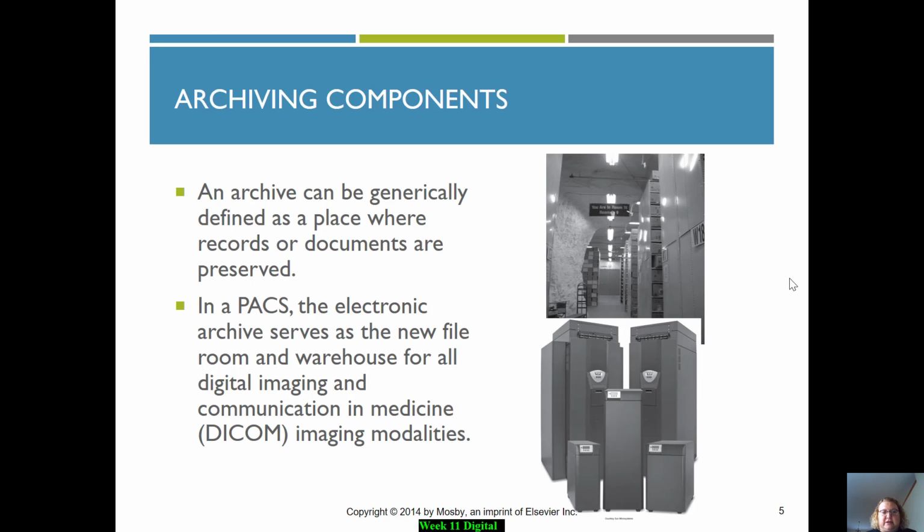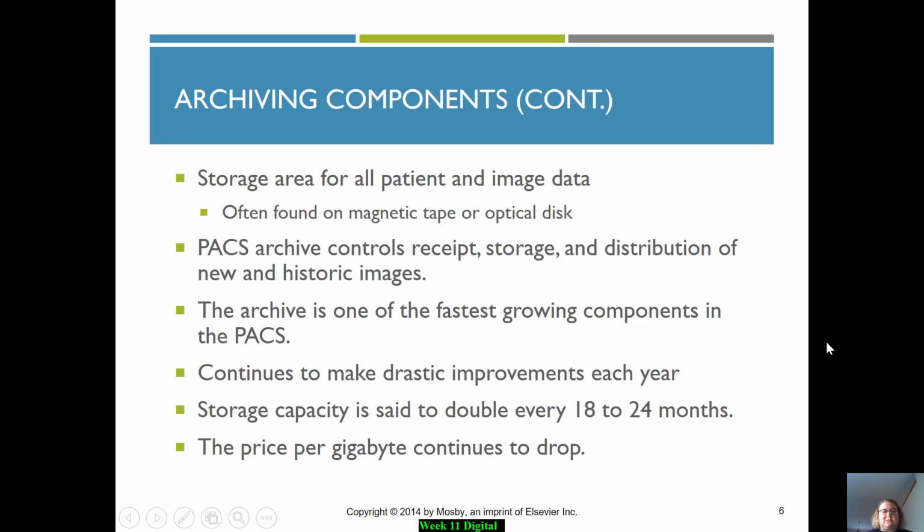Now we don't have to do that because everything's stored electronically in PACS. This is an archiving system that all of the hospitals are using now. They do have to be DICOM compatible so that any machine talks to PACS. You're going to hear the term PACS a lot when you get out to clinical because everybody uses it. Basically it's a storage area for patients. It has all of their data stored with it. Any reports that we've done, anything that's been dictated by your radiologist gets stored in there, and you have access to all of these in PACS.